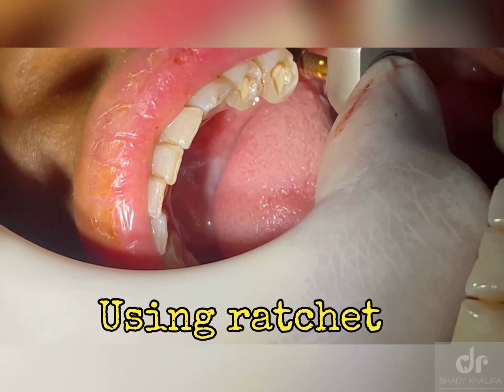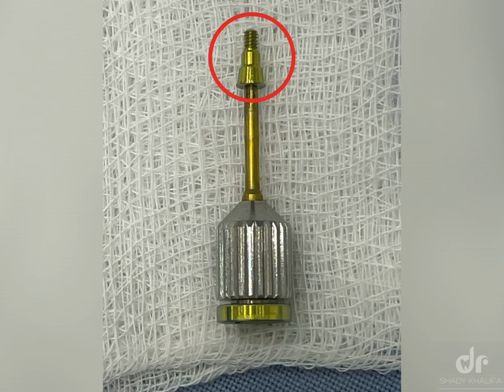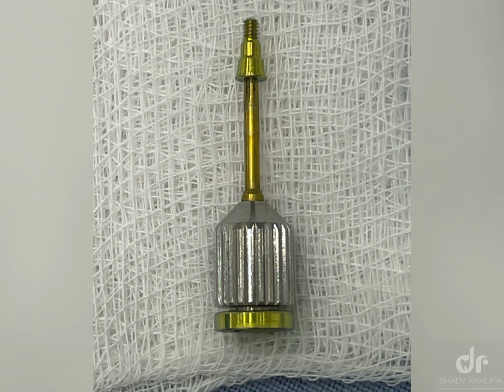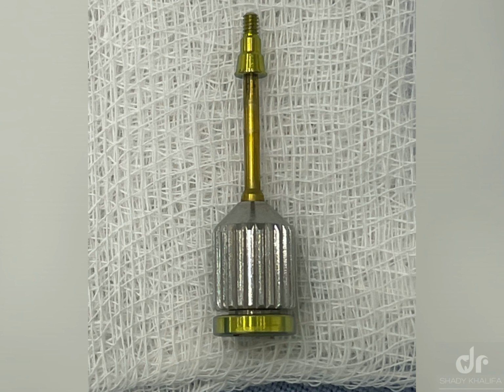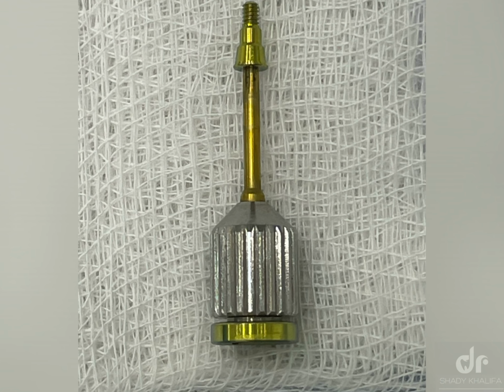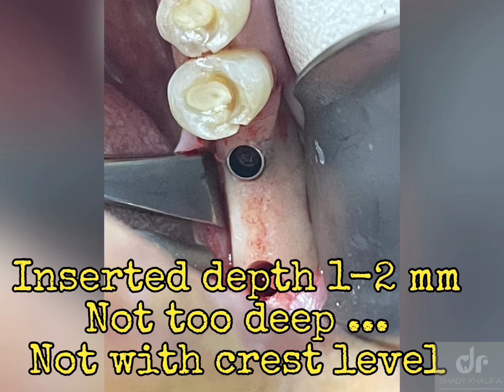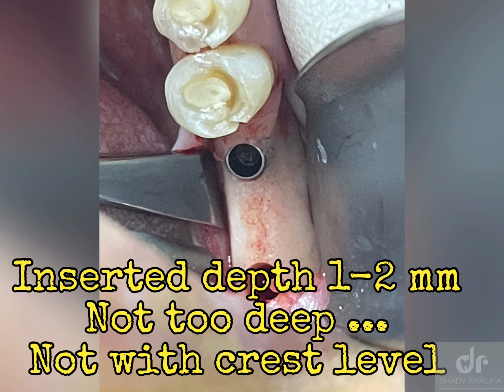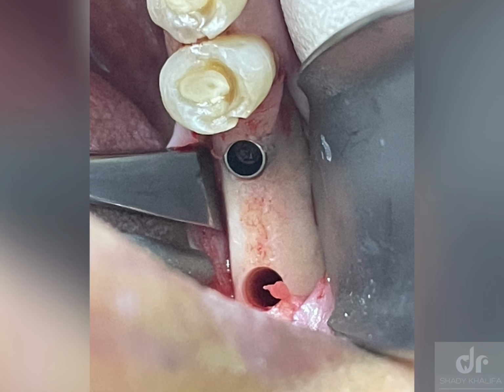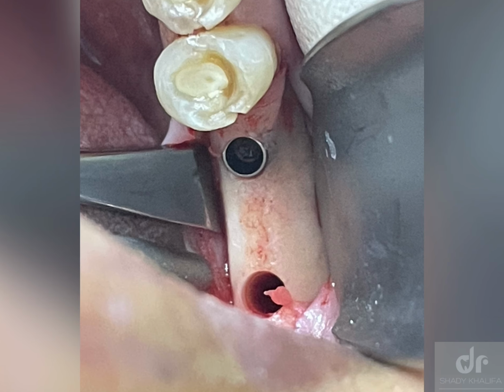This is the cover screw, which we will put after final placement of the implant. I want to mention that we always go down into the bone 1 millimeter to 2 millimeters. So if the bone resorbs 1 millimeter, it will easily be flush with the bone later.